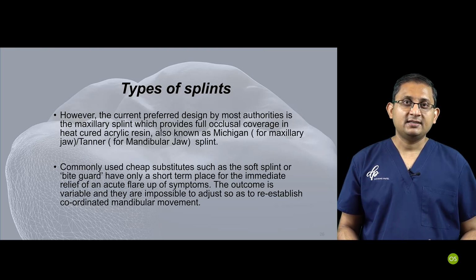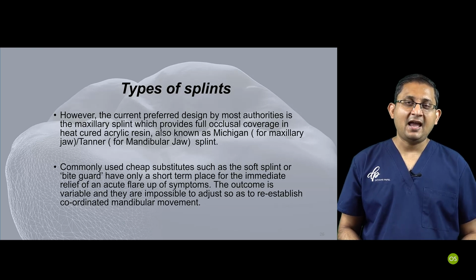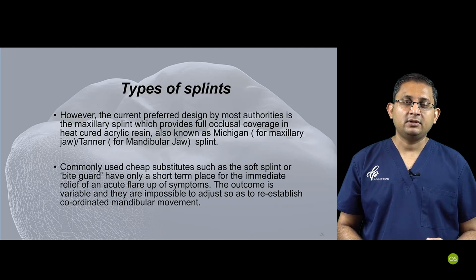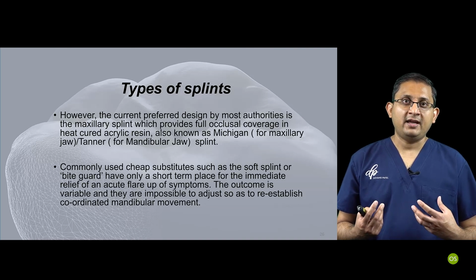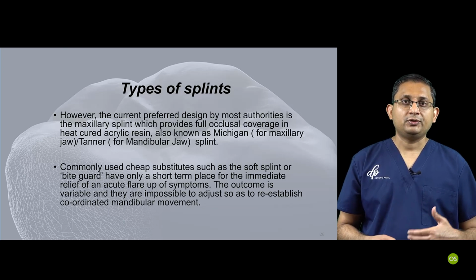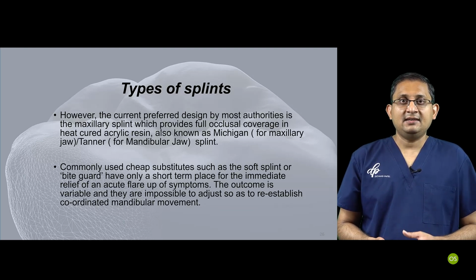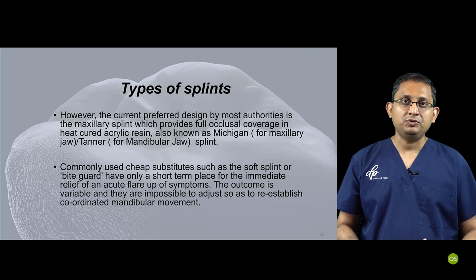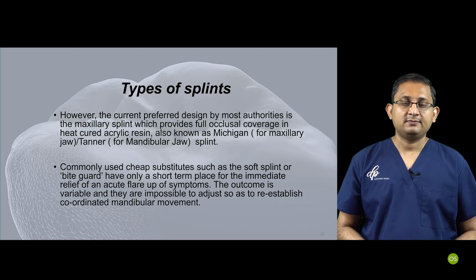Patients sometimes cannot afford it, and sometimes you resort to a soft bite raising appliance. Just be careful that you cannot adjust them. Patients are aware of it, that you cannot adjust them, and it only prevents tooth wear from the bruxism. However, it may cause some other issues. So use it for a short term if you can. Monitor it and see if it's not causing any issues, the patient's happy with it, it's working, okay, you can use it. However, it needs to be monitored like any other splint.